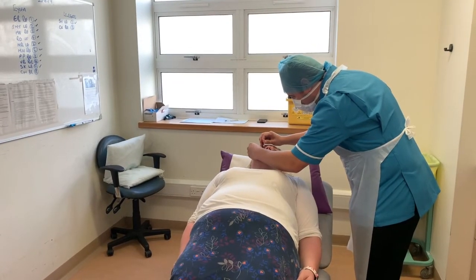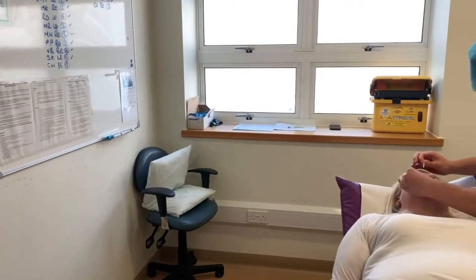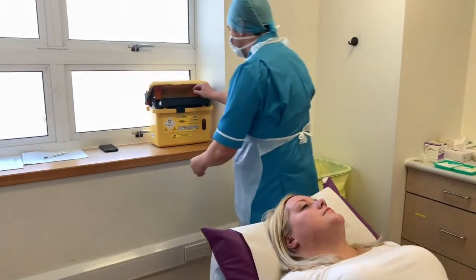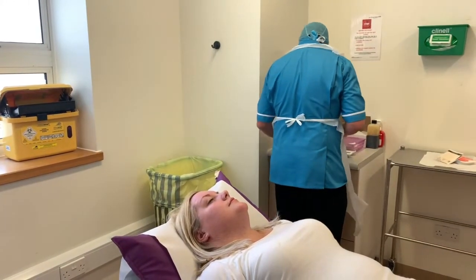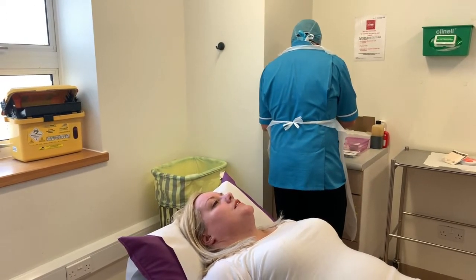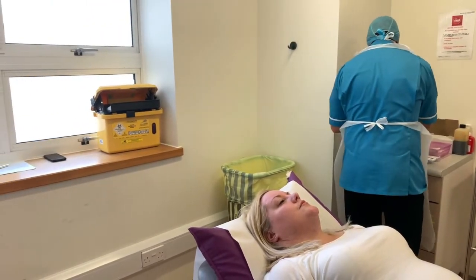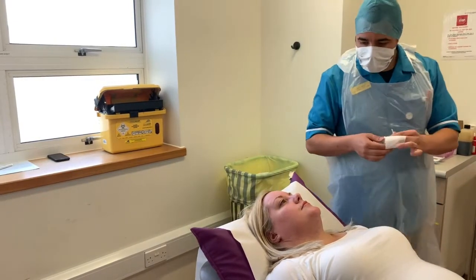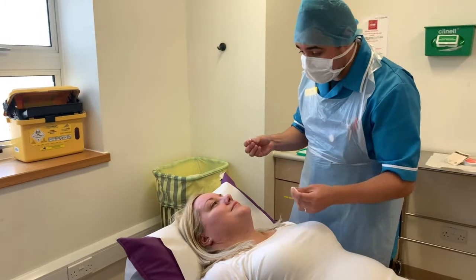Look up again. Face down gently. Okay, just because it was hurting a little bit more, I'm going to put some more anaesthetic in, okay?